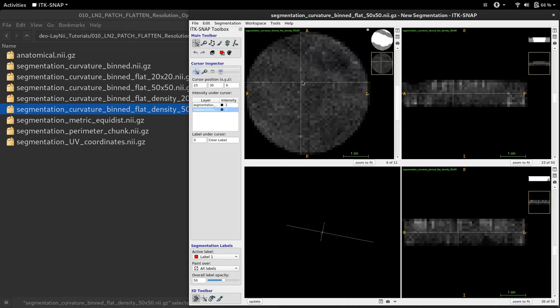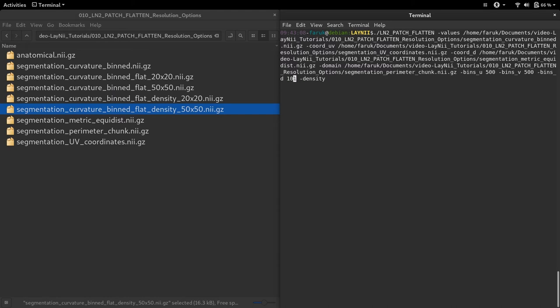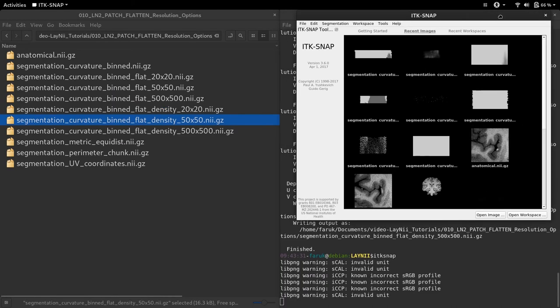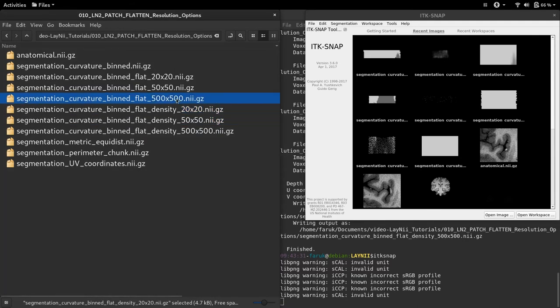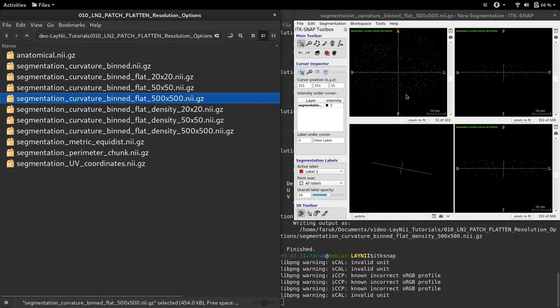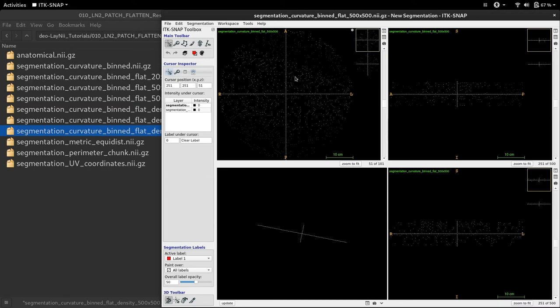Now let's push this example to its extreme. For instance, let's use instead of 50, 500 U and V bins. And also, maybe let's make 101 depth bins. The operation has finished. I'm loading the file. In this 500 by 500 by 101 depth flat representation of the folded brain, we end up seeing an interesting pattern.